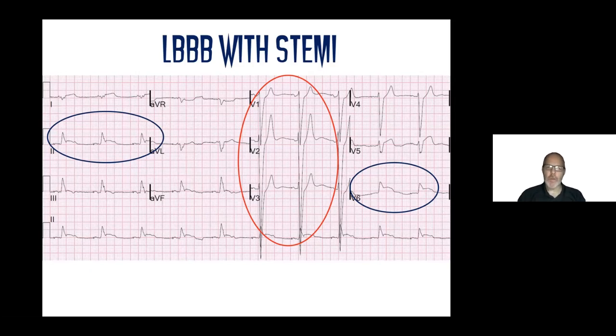Now, here's a million-dollar question. This is your next patient. This is the EKG you're looking at. The patient's complaining of chest pain. Do you pull the trigger in your agency? That I'm going to leave up to a discussion between you and your agency, or you and your region. But I can tell you that protocols around the country are starting this.